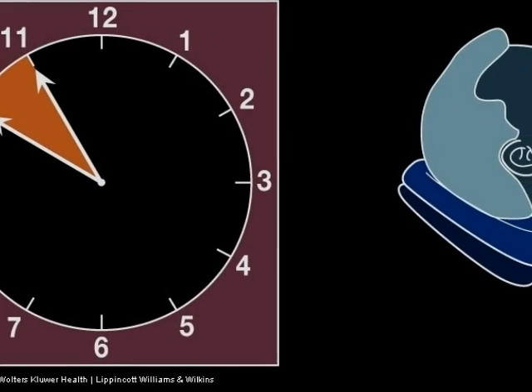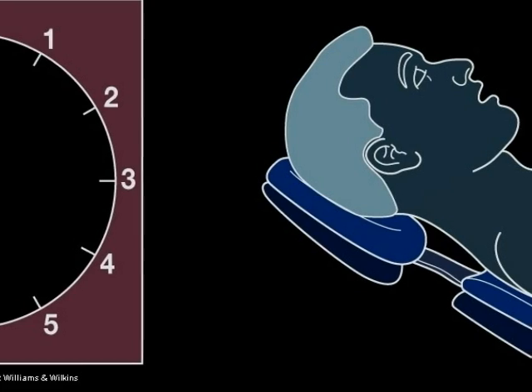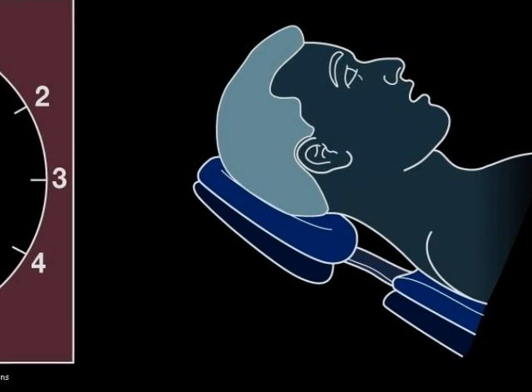As for the mandibular surfaces away, the operator will sit at a 10 to 11 o'clock and the patient's head is tilted slightly down and away.